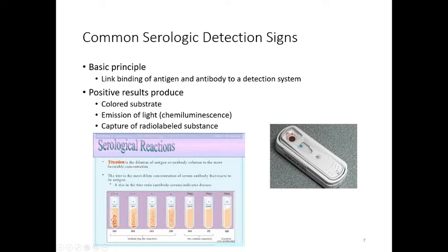It's called a SNAP test. It breaks a glass vial that puts the antigen into the sample, and if the antibody finds the antigen, then it will color the circle that indicates what disease it is. If it doesn't find the antigen, then you just get this negative control, which just tells you that you have a working test.